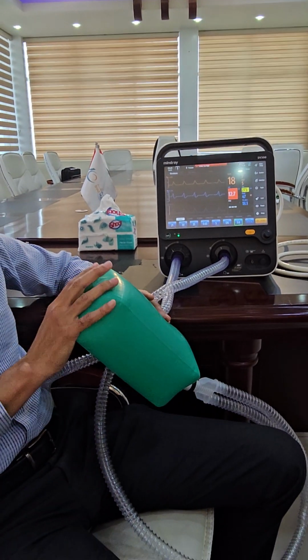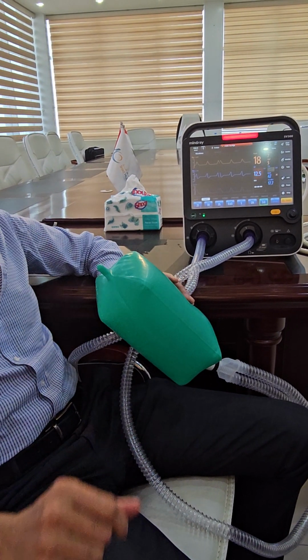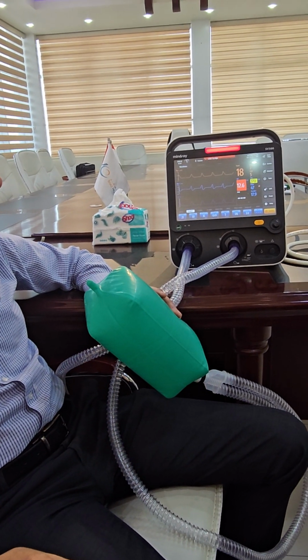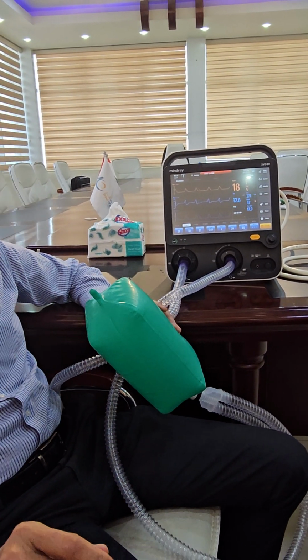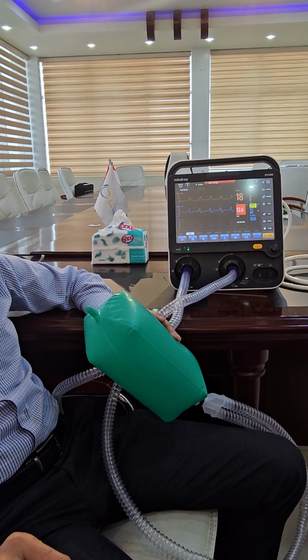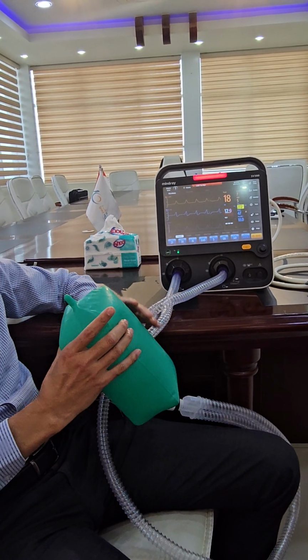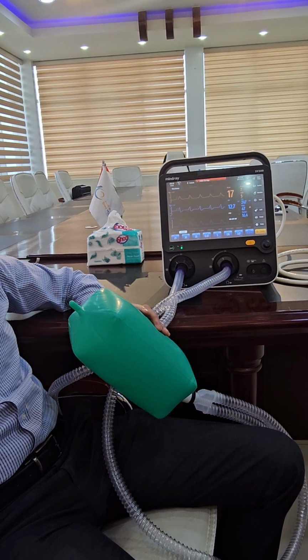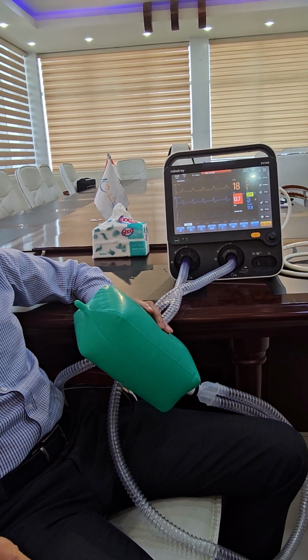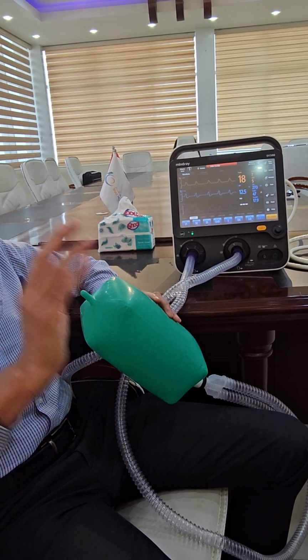Anyhow, it gives the control, the mandatory, and whatever the baby breathes, it will assist. Let's say you set the rate to 35. If the baby breathes 40, how much will the machine give? 5. So the total will be 40. The measured rate will be 40. If the patient breathes 50, the measured rate will be 50. If the baby breathes 40, it's 35 control and 5 assisted.